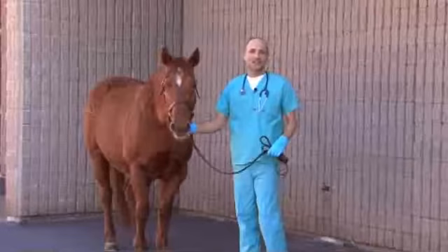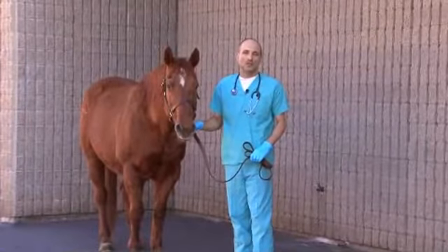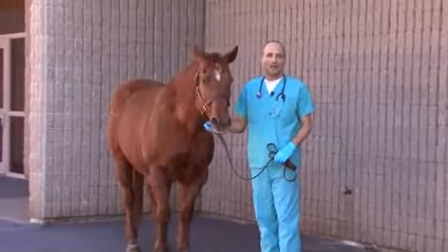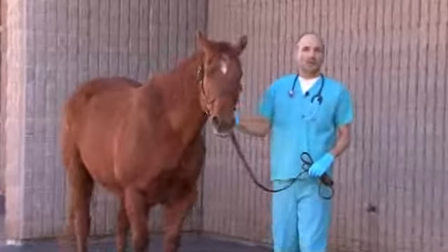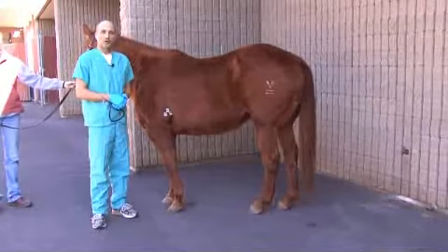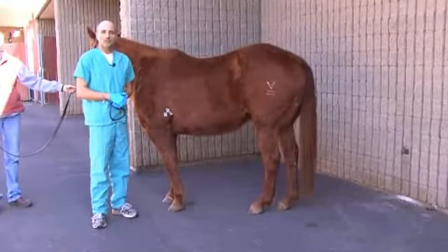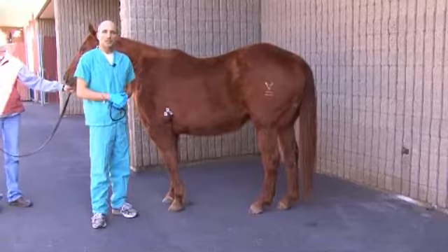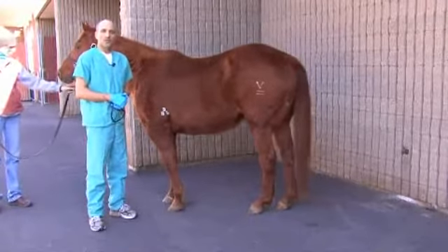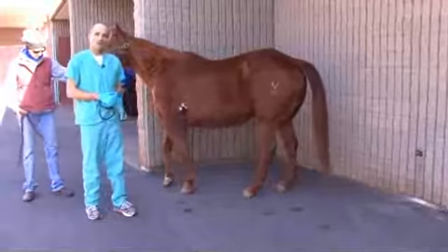Our goal today is to review auscultation of the equine heart, or in simple terms, how to listen to a horse's heart. I'm going to demonstrate that on Peppy and show you the landmarks and how to perform that. First of all, we'll start with reviewing a normal resting heart rate in horses. And that ranges from 28 to 48 beats per minute. Every individual horse has its own normal, and so you should become familiar with what your own individual horse's resting heart rate is.